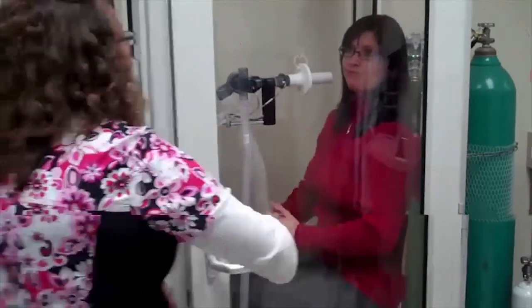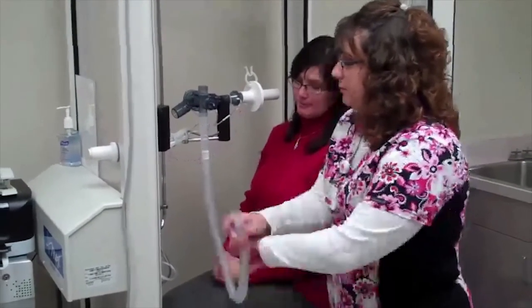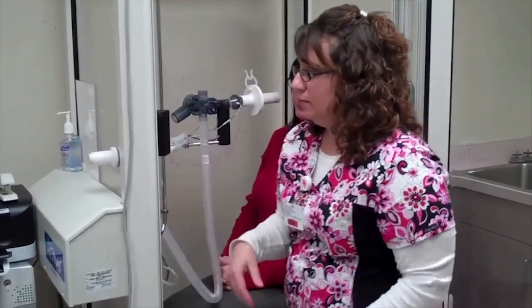Next step will be a diffusion capacity. This assesses the patient's lungs' ability to take oxygen from the air and place it into their bloodstream.